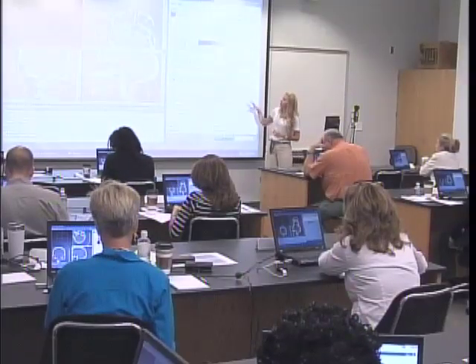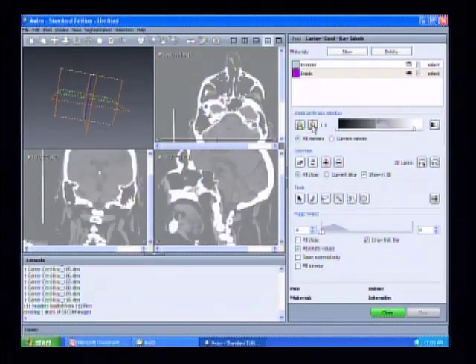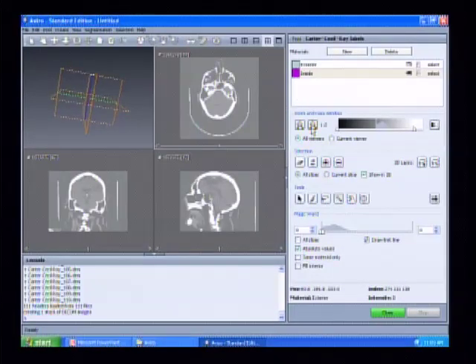So it shows you an image of just this toolbox area, your segmentation tools. And we're going to do this mostly for the cervical vertebrae that we're going to try to remove from our model because we cropped it. I'll start off with these zoom buttons here. You can kind of zoom out. You have zoom and data window.